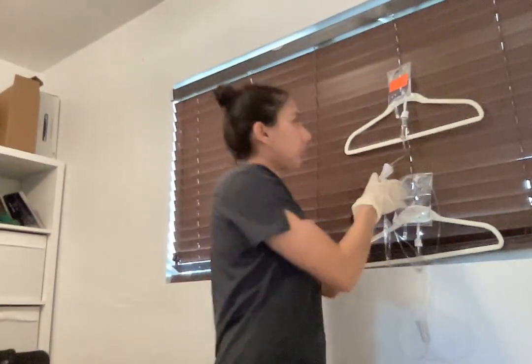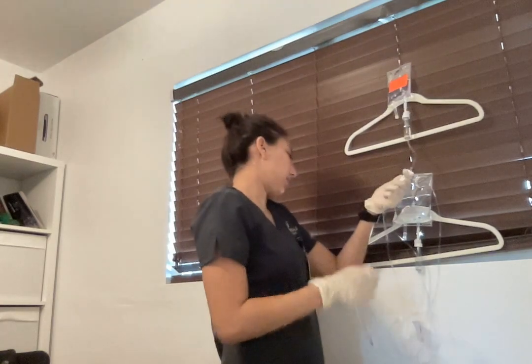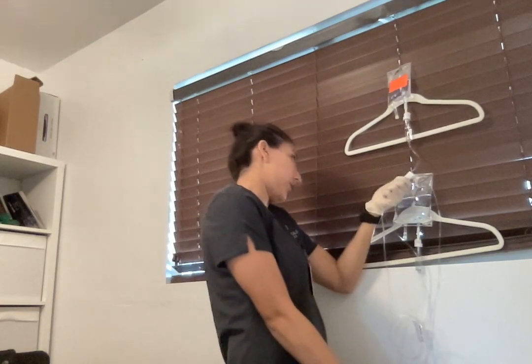Because for the medication, we do want 100 drops. And then for the IV fluid, 38. So for the meantime, right now, we're gonna do the medication.